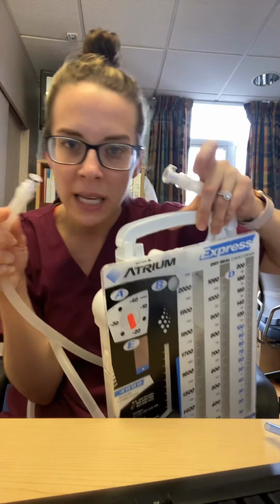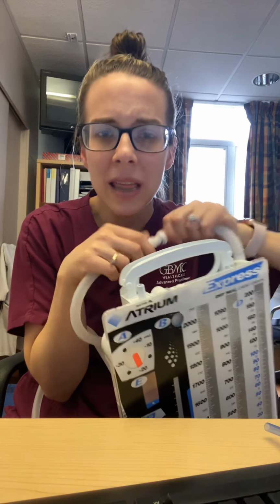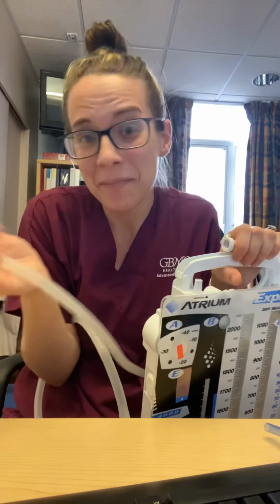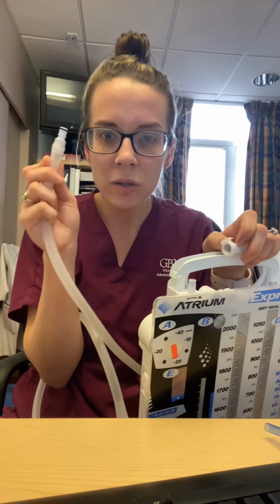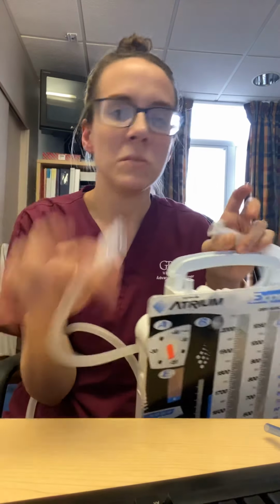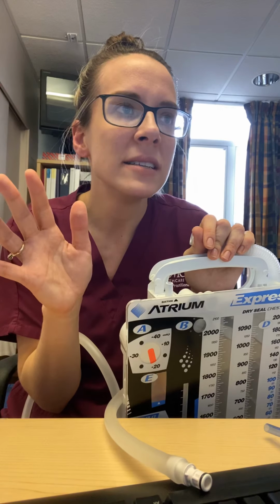This is just going to be in mini size, and we're just going to click in, but on the mini instead of the big one. I made that a lot more difficult for myself. Okay, so that's it. And this is a closed system, so once you unclick and you click into the other, you're good to go. So that's it. It's really simple. And then there's nothing further that needs to be done.